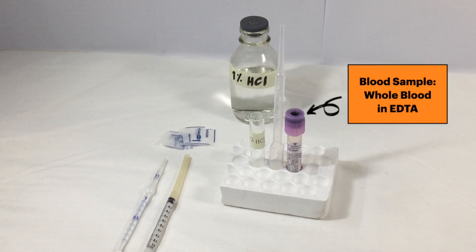And of course, our blood sample, which in this case is found in an EDTA tube.